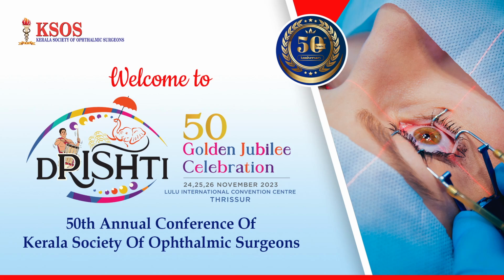And this was the surgical procedure. Superior small conjunctival peritomy, followed by marking the scleral tunnels and, with the crescent, making a pocket using the 1.5 millimeter keratome. Two Gabor pockets are created. Then all three ports are put. The SICS tunnel is made superiorly, and then a complete vitrectomy is done.